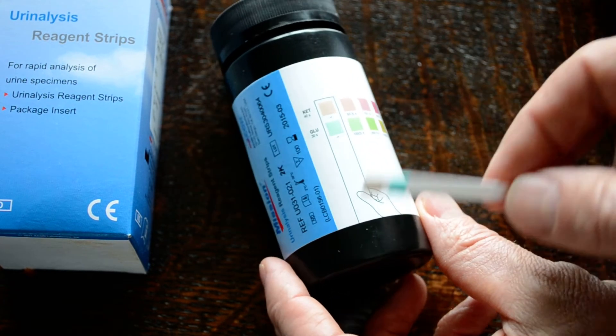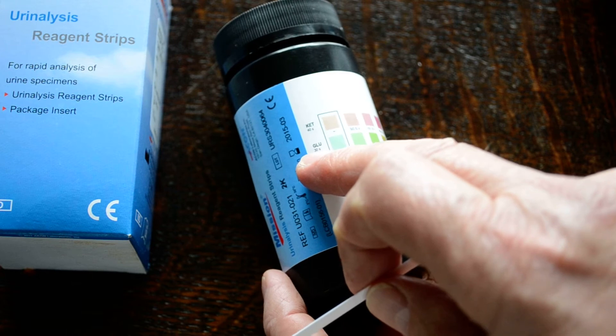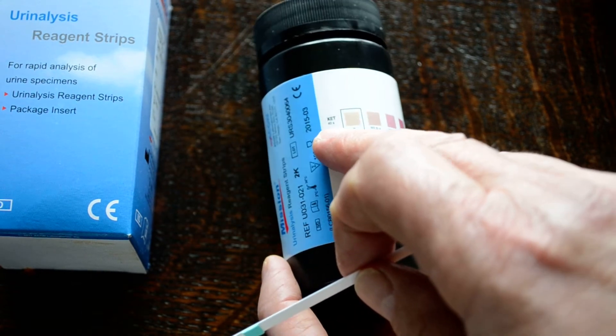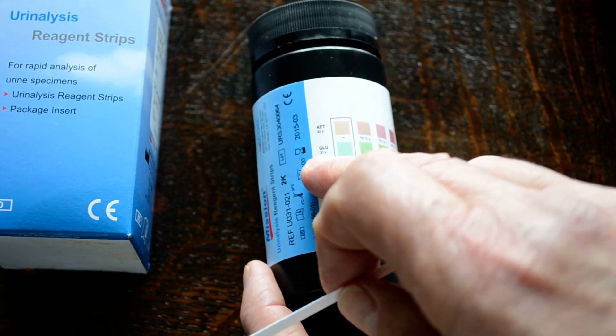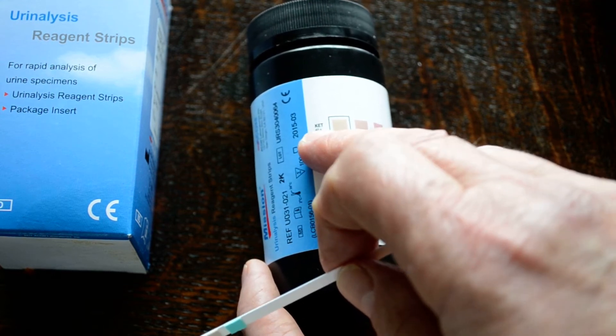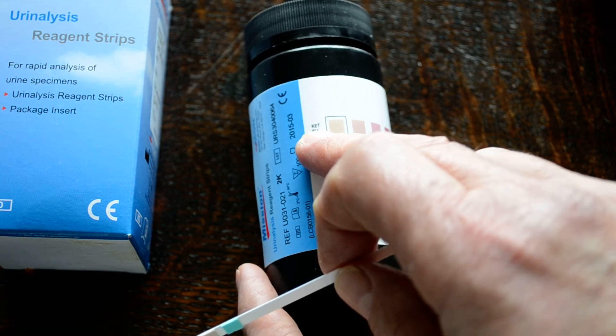Before you do this test, it's important to look at the read times in seconds, which are in very small print just below the abbreviations for KET and glucose. Glucose is the first to be read at 30 seconds, and ketones 10 seconds later at 40 seconds.